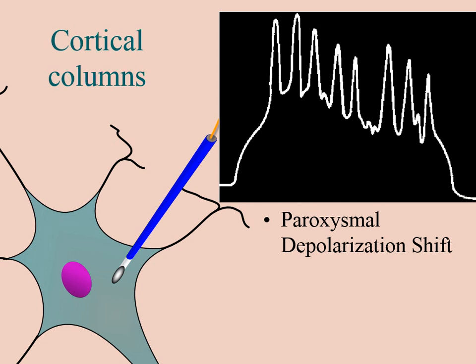So if we go back to our party analogy, it's like there's a party going on, but all of a sudden a bunch of rowdies in the corner all start clapping together. And every time they clap, they make this big noise that can override the baseline noise, and you get this big blip in the needle on the decibel meter. And that is basically an epileptic spike.